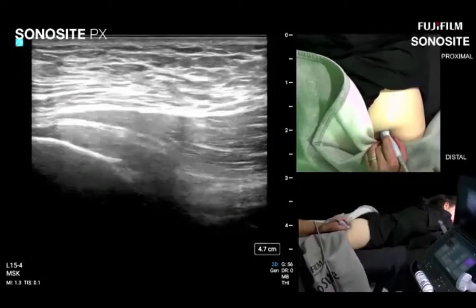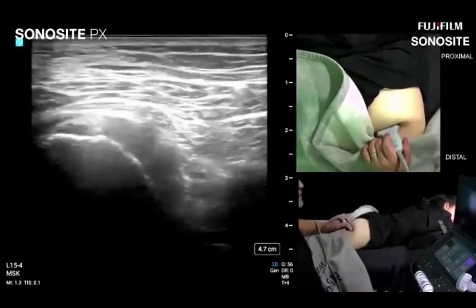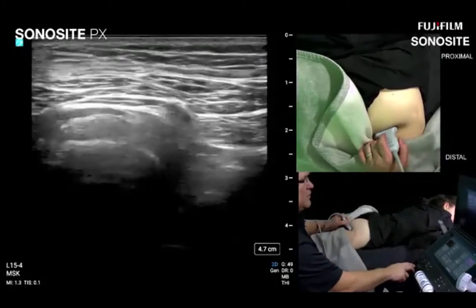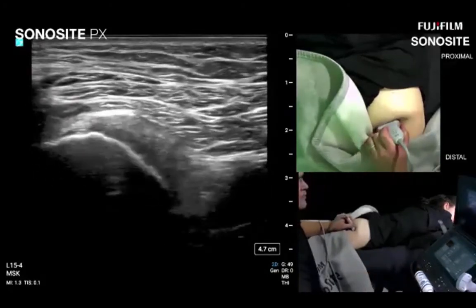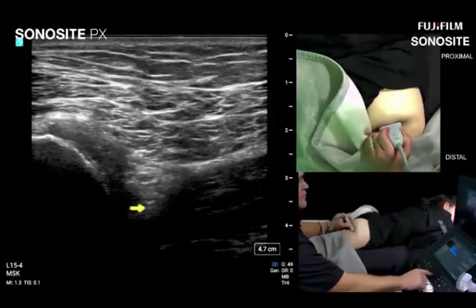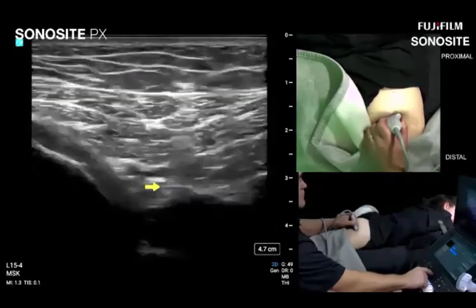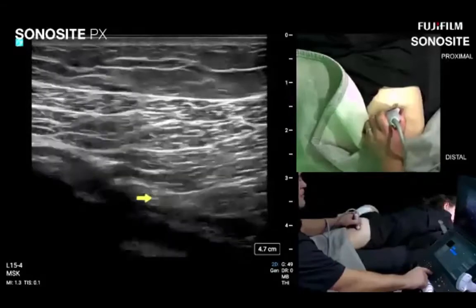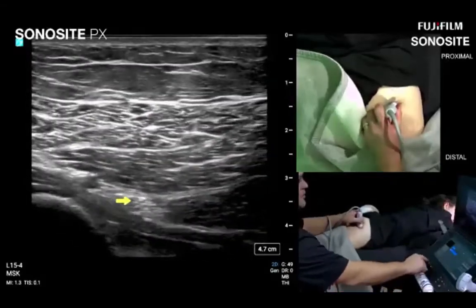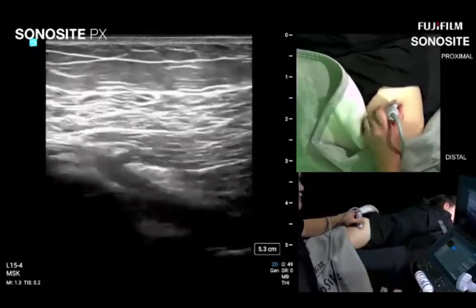Moving laterally to the sciatic nerve, going back to cross-section: ischial tuberosity is visible again, sciatic nerve is clearly seen, and quadratus femoris just to check our work. Rather than trace the sciatic nerve proximally again, let's follow it distally — adding a little gel to maintain contact along the track down. Cross-section is the way to go when following nerves; turn the gain down slightly for optimal visibility and follow the sciatic nerve distally.